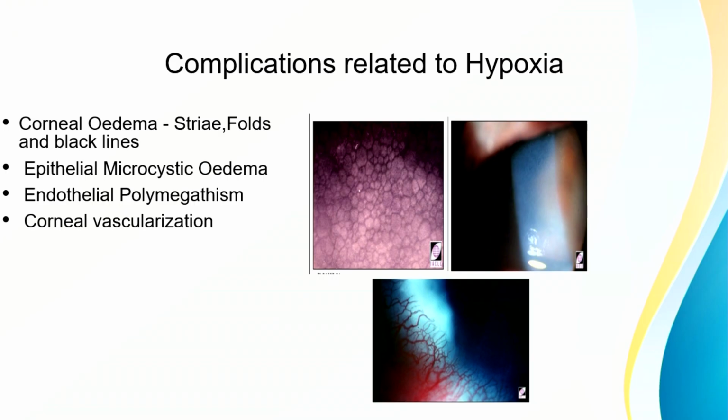where corneal edema, microcystic edema, polymegathism and corneal vascularization are the more common things which we come up with in the clinic.